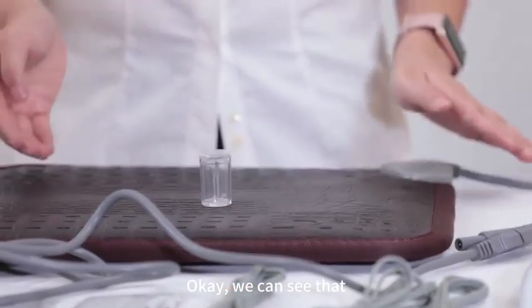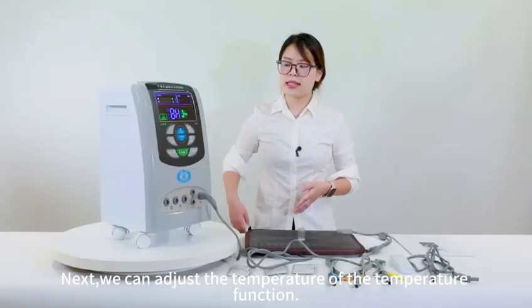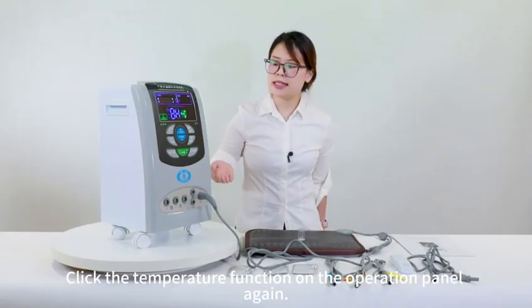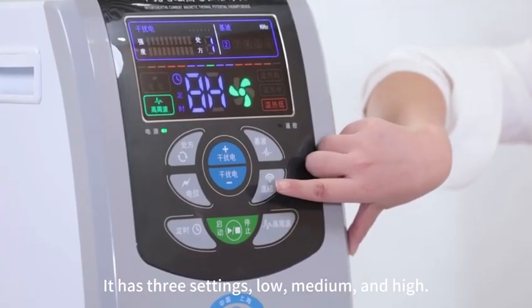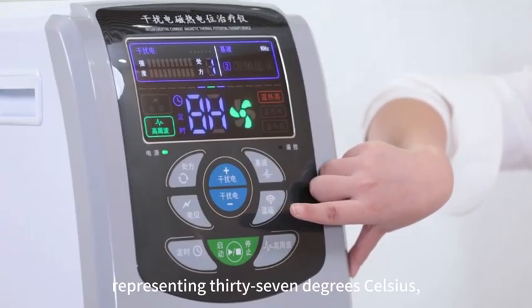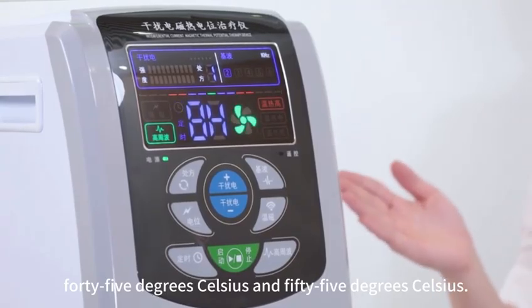Okay, we can see that the magnetic bead is jumping up and down, left and right, which proves that it has magnetism. Next, we can adjust the temperature of the temperature function. Click the temperature function on the operation panel again. Low heat. It has 3 settings: low, medium, and high, representing 37 degrees Celsius, 45 degrees Celsius, and 55 degrees Celsius.